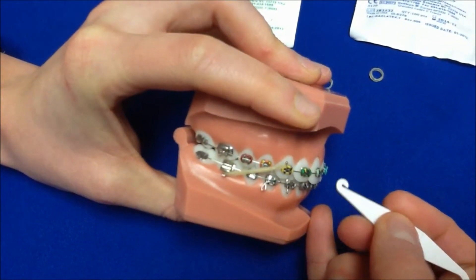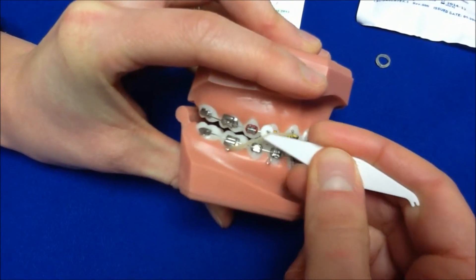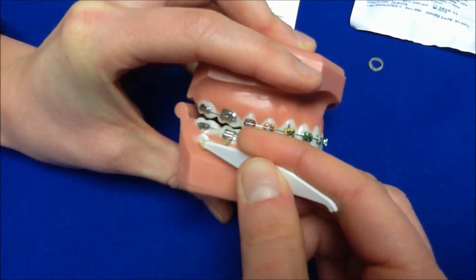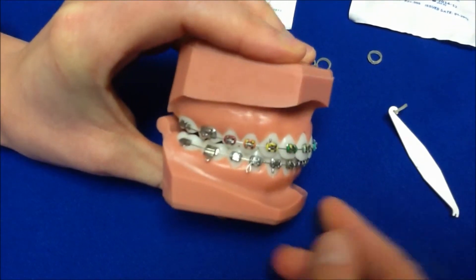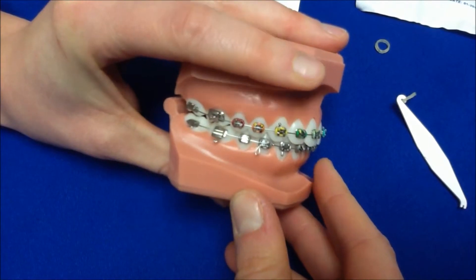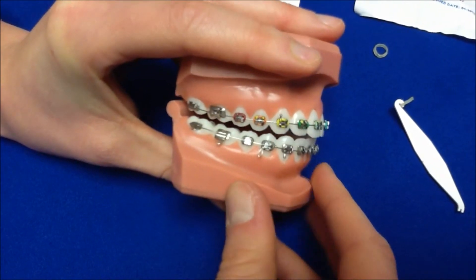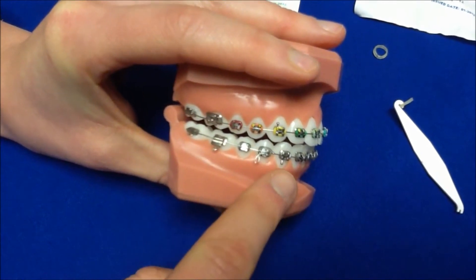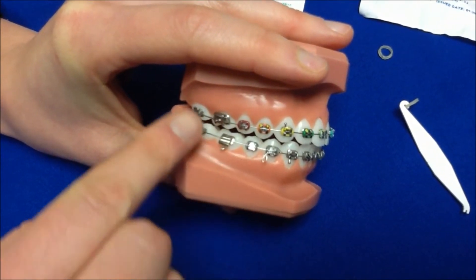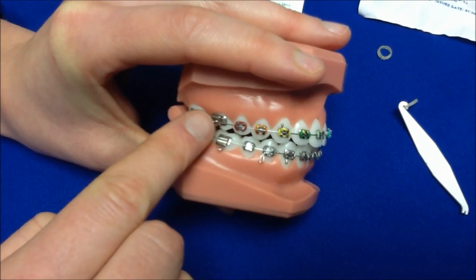As you get more comfortable with your elastics, you'll probably put them on with your fingers and will no longer need the tool for placement. Another very common type of rubber band worn in our office is a class III elastic. This is typically for cases that have an underbite. Class III elastics are worn from the lower canine to the upper molar.